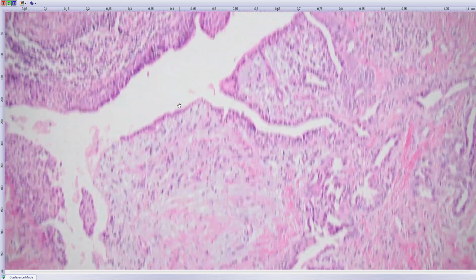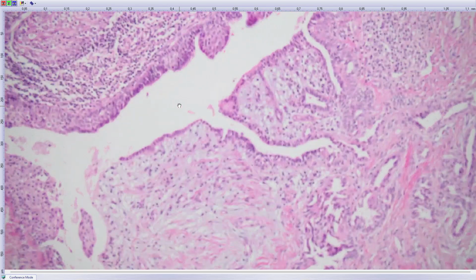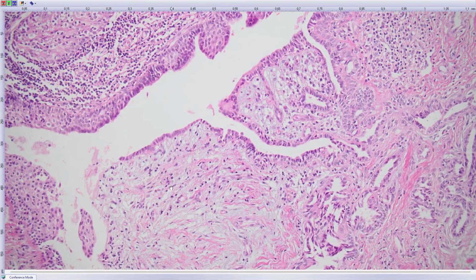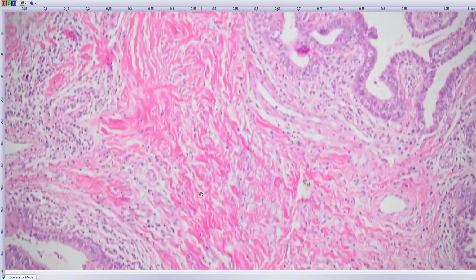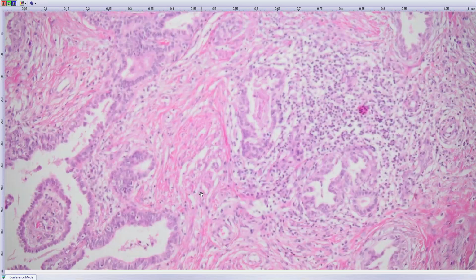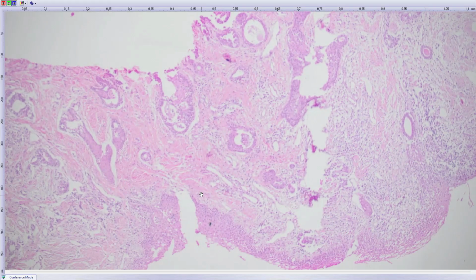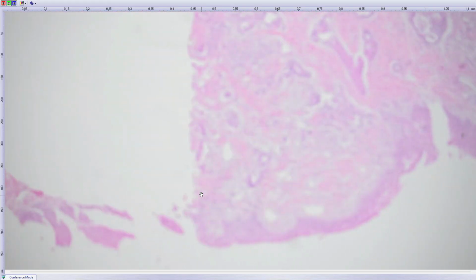Still, there is some neoplastic stroma, very incipient spindle cell spindling. You see it, for example, here, yeah? There's some spindling here. In another case I will show you, a case I got from Brazil, again, newborn, nasopharynx, and I think we see here entirely the same thing. Yeah?